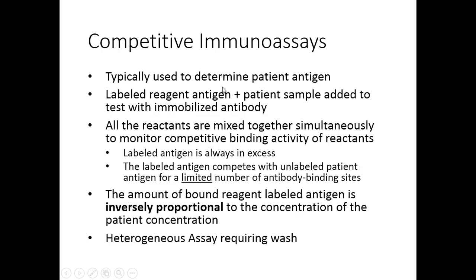Let's see what else. As I said, the labeled antigen competes with the unlabeled patient antigen for those antibody binding sites. We're going to see that in an illustration in just a minute. Just remember this for now.